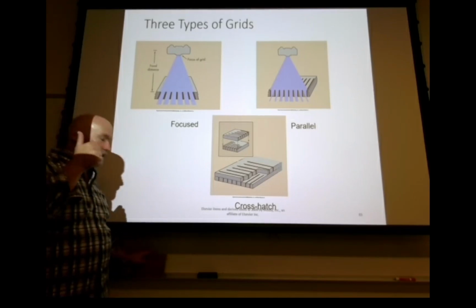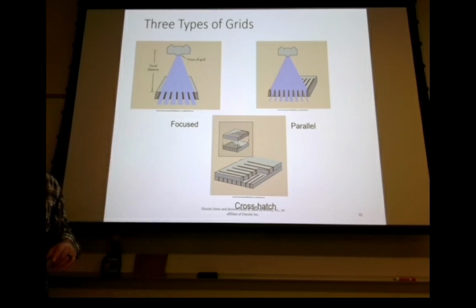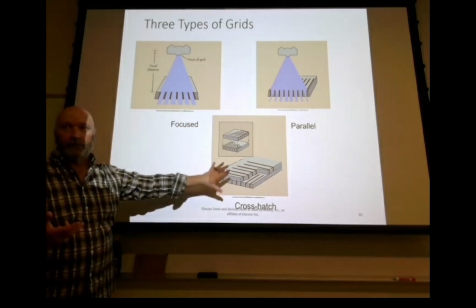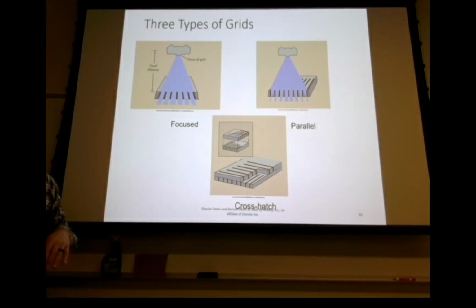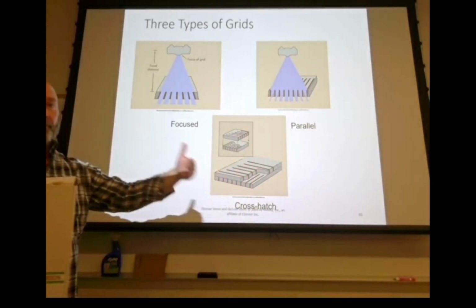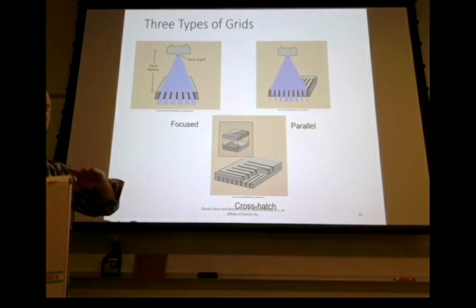The benefit is that they're cheap to construct, they're easy to construct, they're very versatile. We're going to talk about these two and the lack of versatility in them, but they're very versatile compared to other types, and overall likelihood of getting grid cutoff is lower with parallel than with any other. Okay, so I'm going to pass around a couple of grids to take a look at. So the likelihood to get grid cutoff is highest with parallel or lowest? Well, it's always going to be present in the periphery, but as far as all the way across the image, it's less likely.